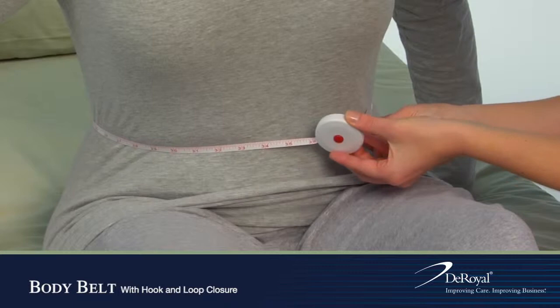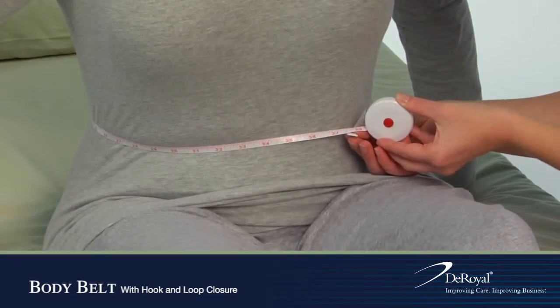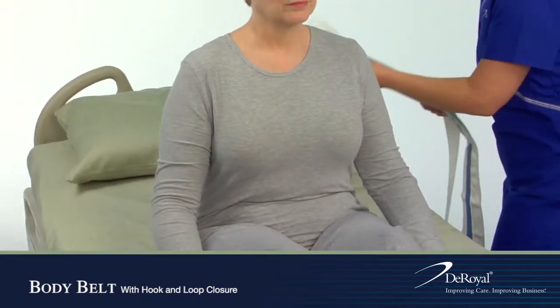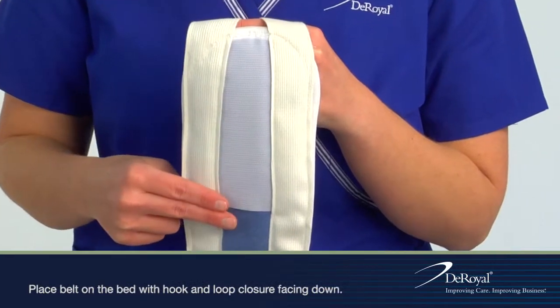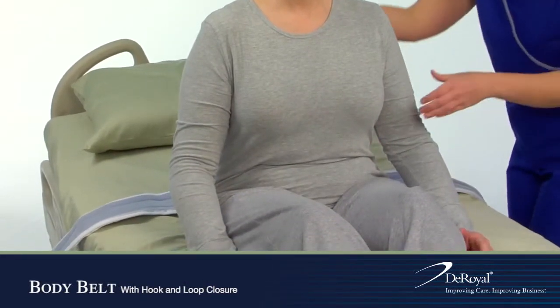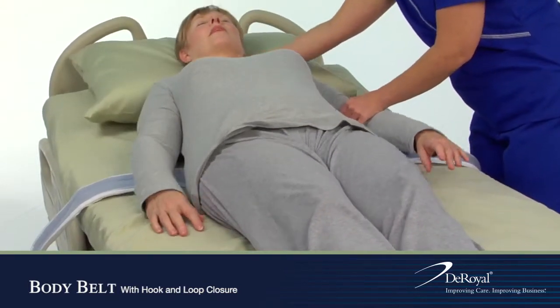Measure the circumference of the patient's waist to determine appropriate size. Place the belt on the center of the bed at the patient's waistline facing down. Position the patient on his or her back.